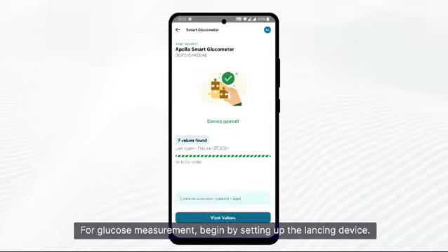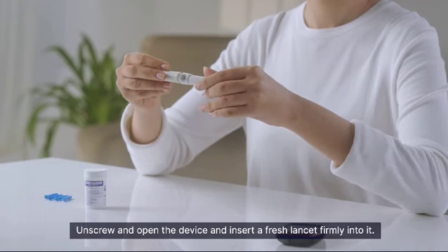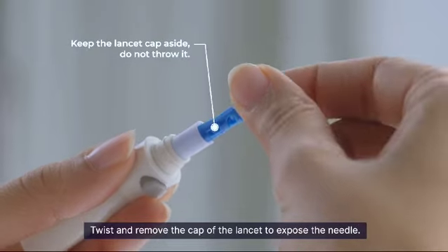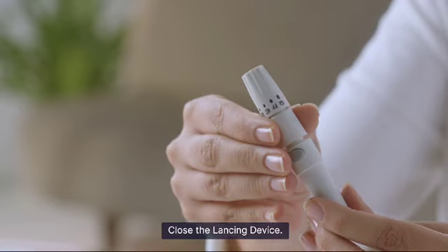For glucose measurement, begin by setting up the lancing device. Unscrew and open the device and insert a fresh lancet firmly into it. Twist and remove the cap of the lancet to expose the needle, then close the lancing device.